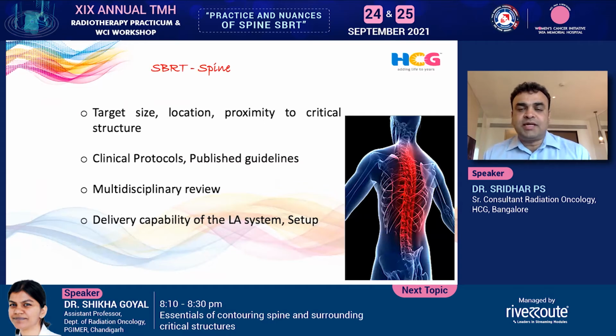SBRT spine. Now, when we started SBRT 15 years back, it was very small. It was in baby steps, in an infant state. Now it is definitely taking shape. SBRT is important across all the tumors. Importantly, in the coming years, the epithelial, prostate, and lung, where the radiation oncologists are lagging behind, is the future. SBRT spine is one of the things which has already started. We have an experience of more than 20 years, starting from the brain and the spine.